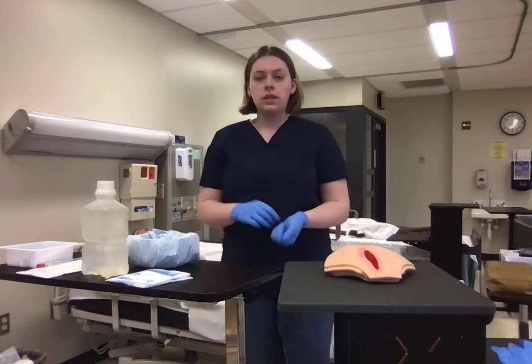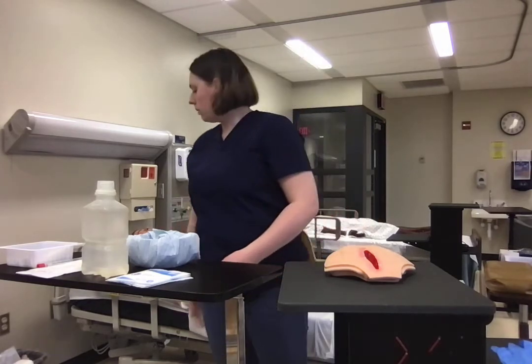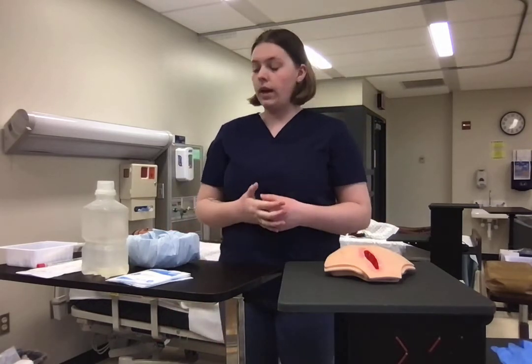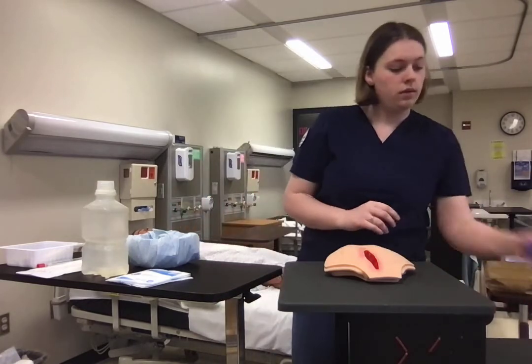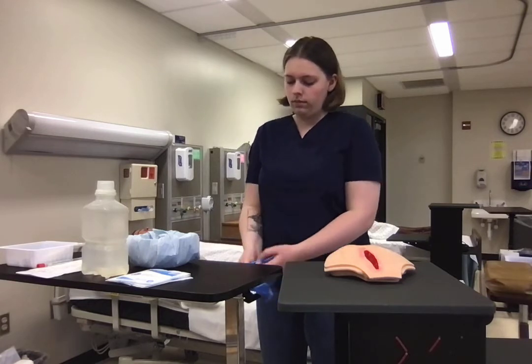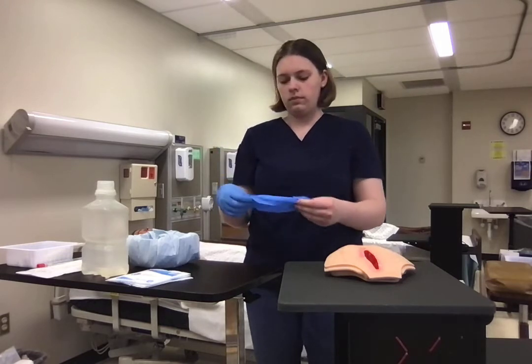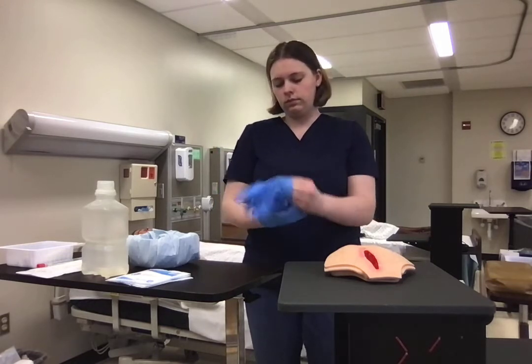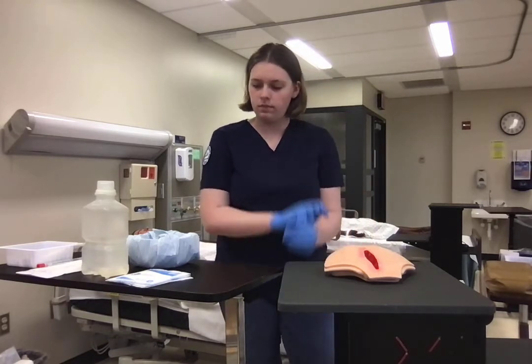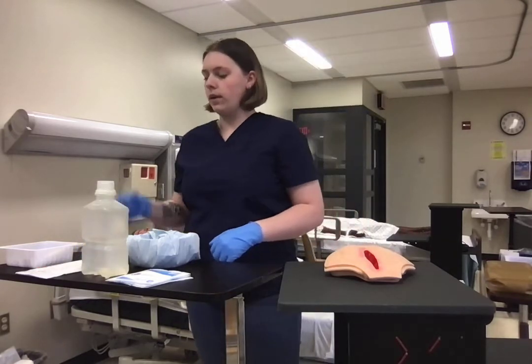At this point, my gloves are dirty, so I will remove my gloves and perform hand hygiene once again. All right, and I'm going to put on another pair of clean gloves because at this point I'm going to be taking a wound culture. All right, so I have my clean gloves on. I will go ahead and grab my wound culturette.